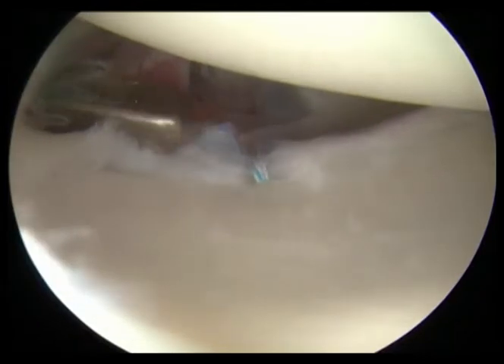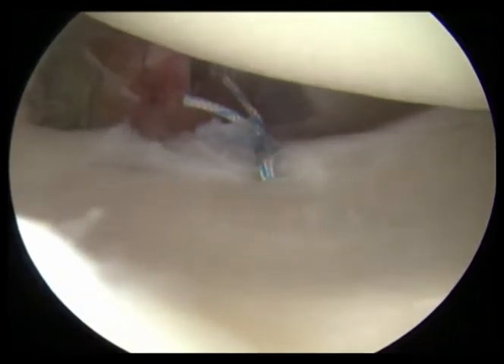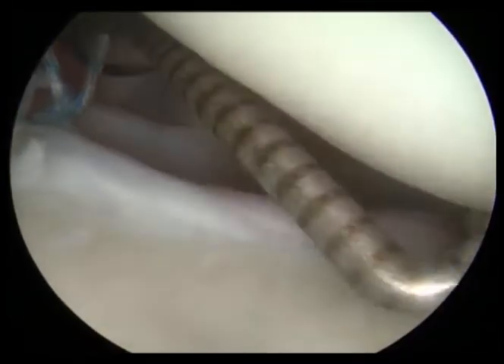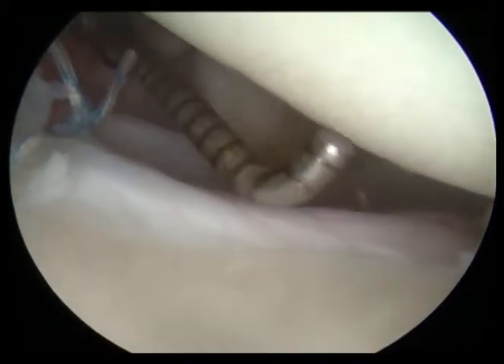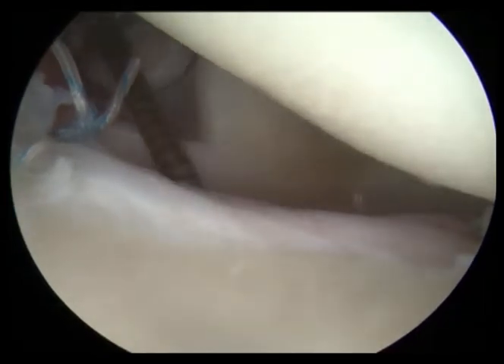Here we are cutting the suture, and then we're going to place a probe in and look at how nice and tight this labrum is. That's a demonstration of a labral repair and a SLAP lesion repair as well.